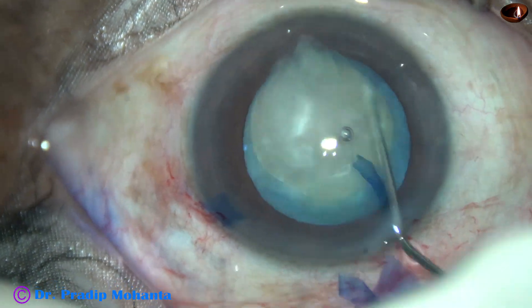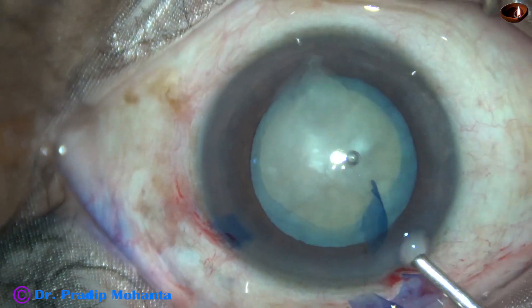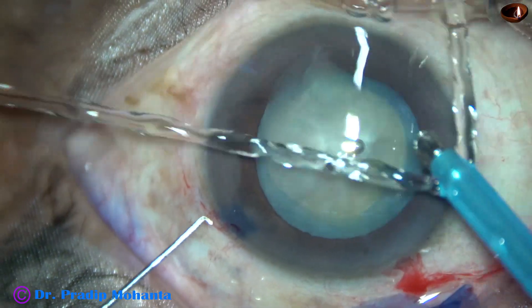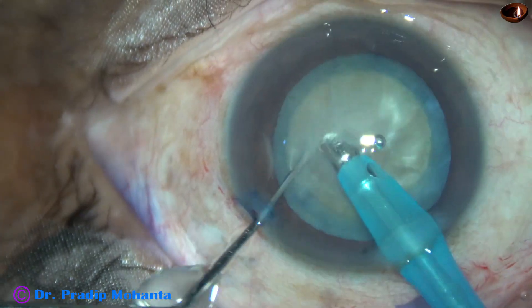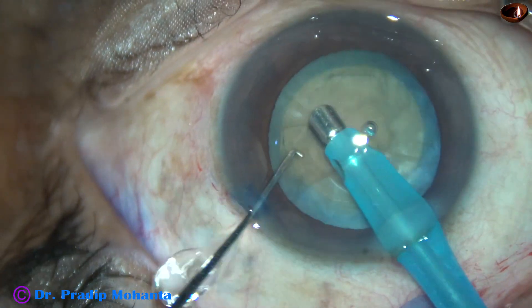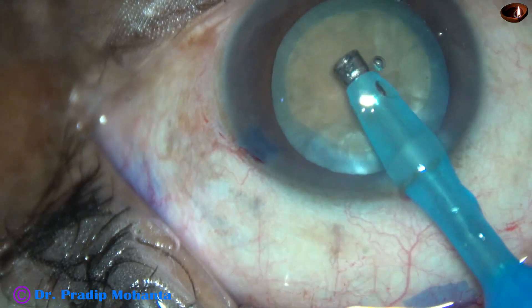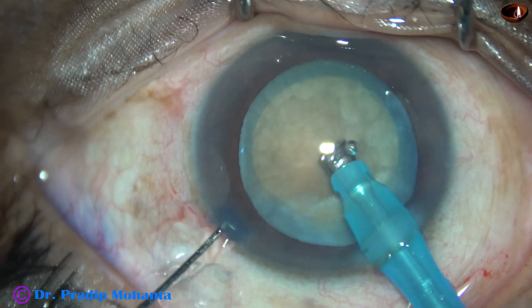Very little hydrodissection is being done — a lot of fluid is not injected. Now is the time to introduce the phaco needle. Here it goes. Some superficial cortical lens matter is removed. Now the handpiece is turned to make the tip up towards the corneal endothelium.